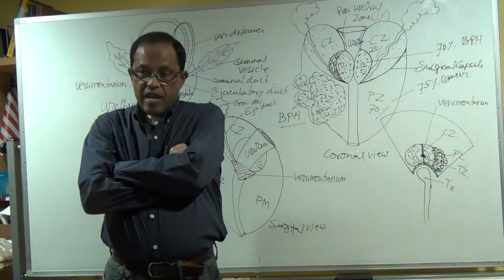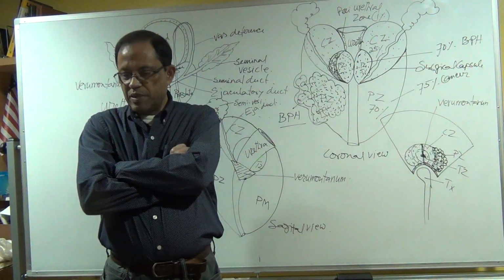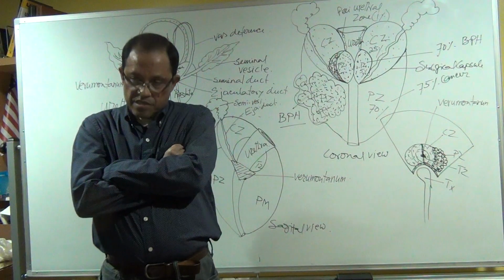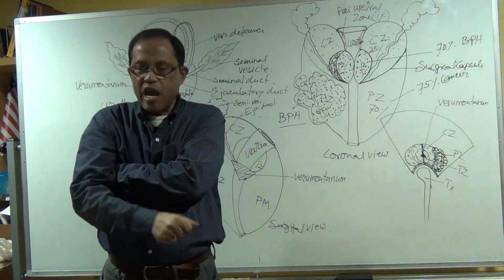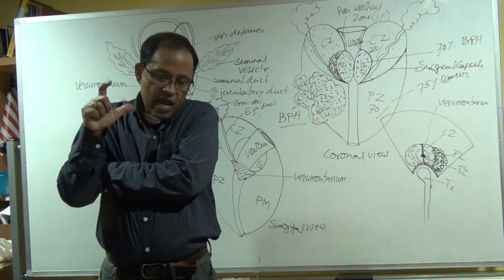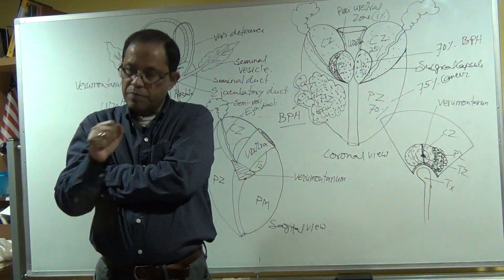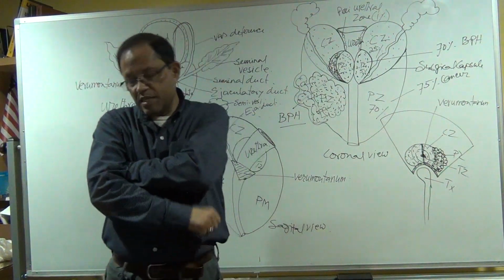The prostate gland can be evaluated transvesical and transrectal. Transvesical means transabdominal, right? Okay, with a full bladder, fine. But the problem is, in transabdominal, the symphysis pubis interferes with the ultrasound. It gives a lot of shadow. That's why you cannot see the details of the prostate gland. But you can assume whether the prostate gland is enlarged or not. If it is enlarged, it could be BPH or it could be malignancy. So then do the rectal examination.